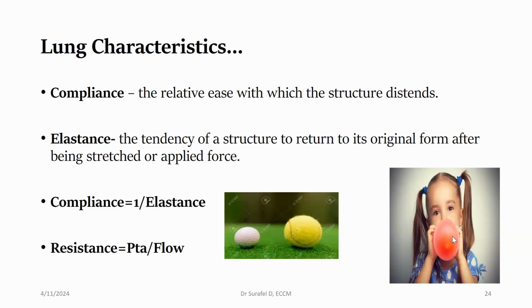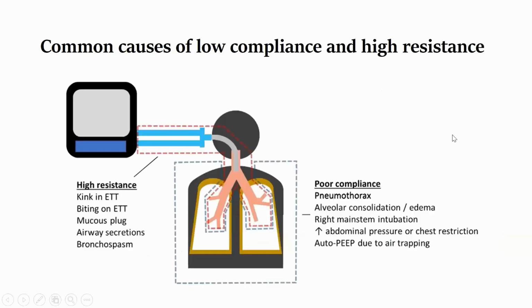That's why we apply a very high PEEP for a patient with ARDS, so that it will be easier to ventilate with a low pressure. As you go through inflating a balloon, you'll need less pressure to ventilate the lung. So I think the concepts of ventilation, compliance and elastance are clear. If there's any question, you can ask later.